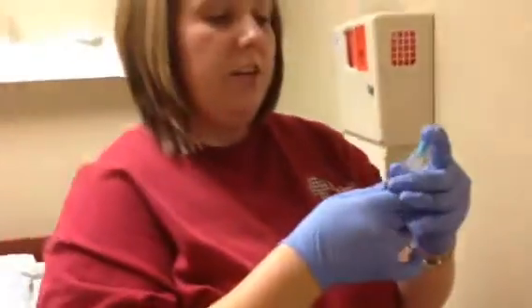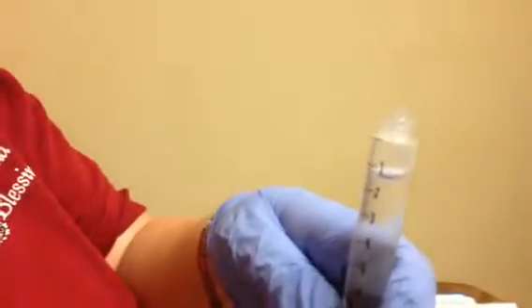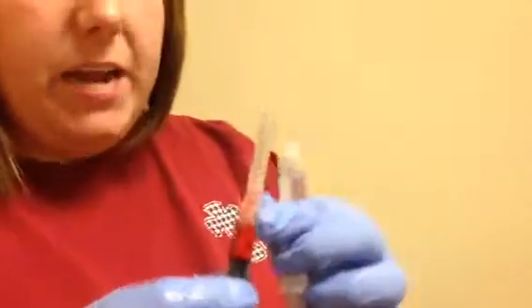And just keep in mind, students, that it's always better to over-dilute a medication than under-dilute it because of the way that it can affect the veins, okay? Alright. So at this point, I'm going to take this cap off. I'm going to pull back just a little bit to give me some room. Alright, remember, I've already measured my medication. I've made sure it's accurate. So now I'm going to take my medication and place it into my saline, okay?